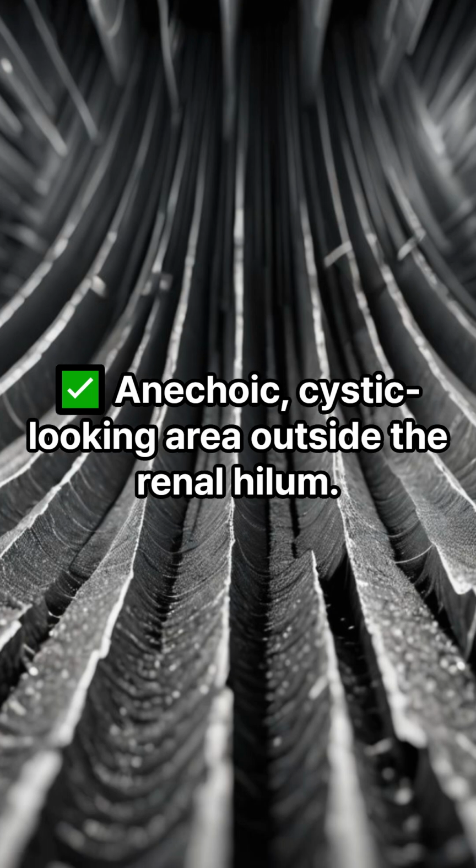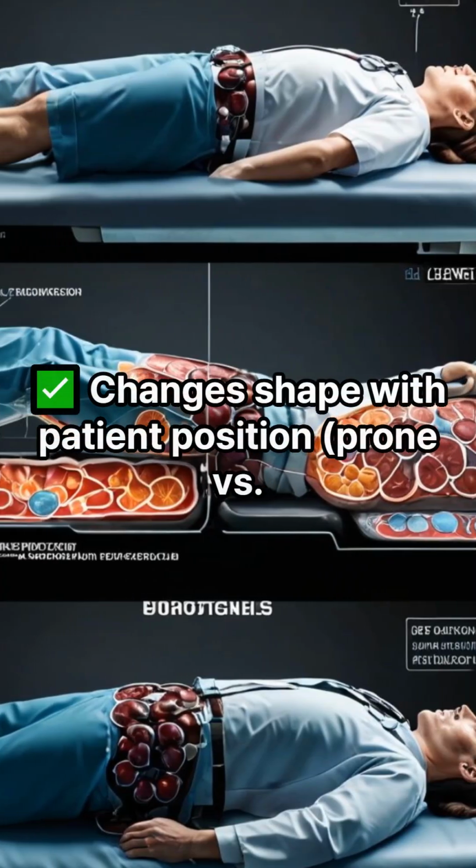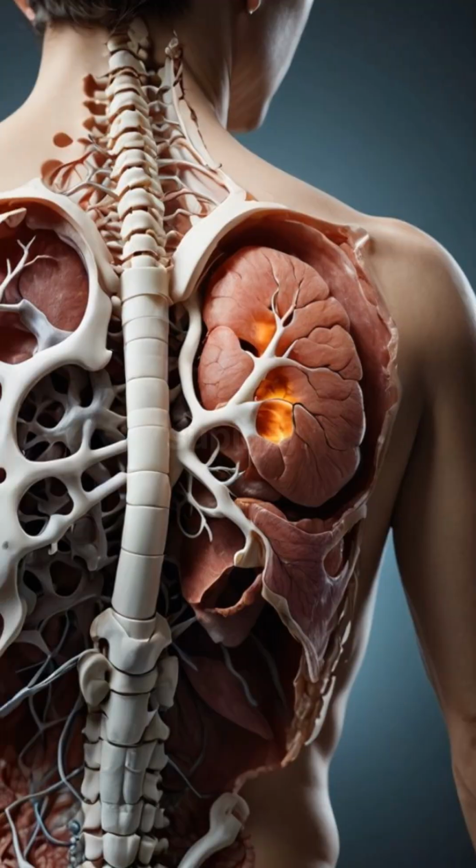Sonographic appearance. Anechoic, cystic-looking area outside the renal hilum. No cortical thinning, unlike chronic hydronephrosis. Changes shape with patient position, prone versus supine.